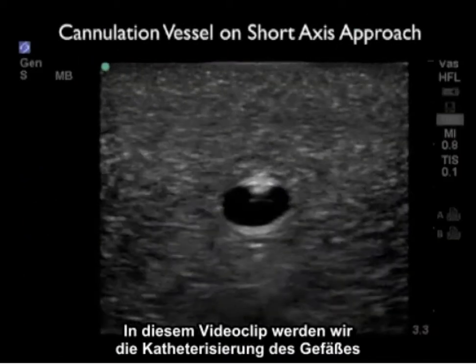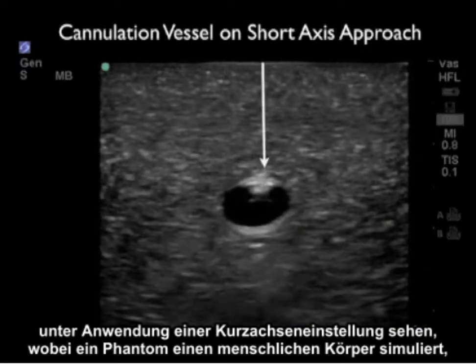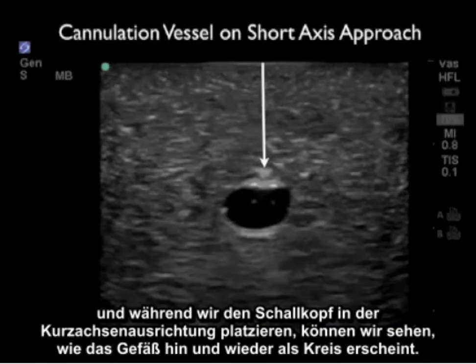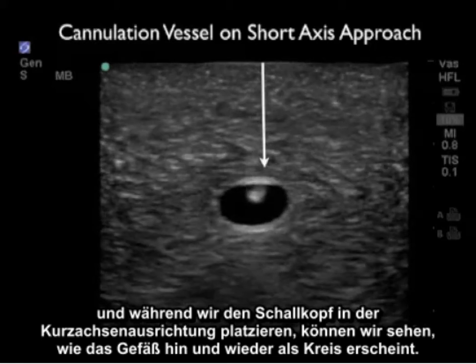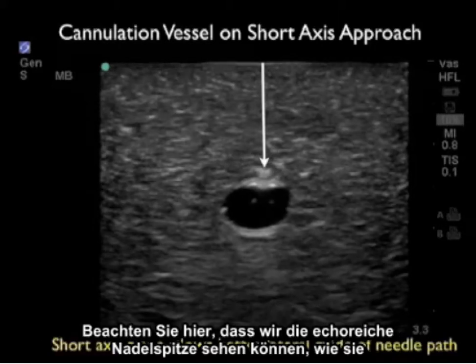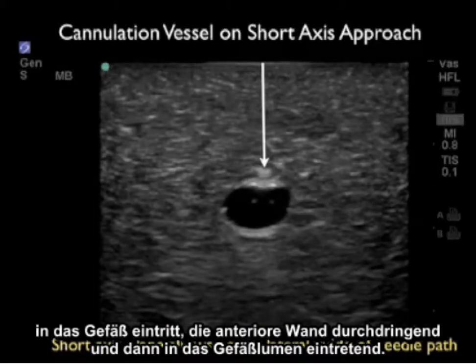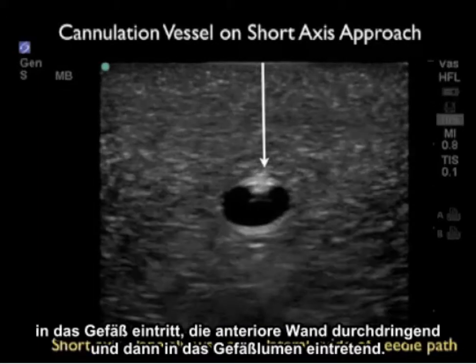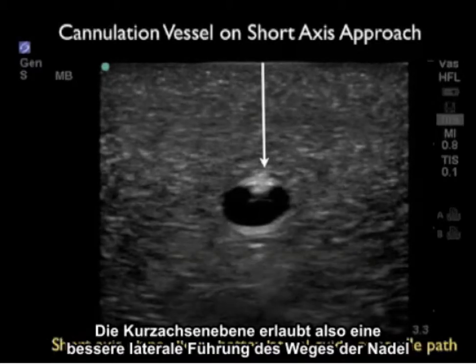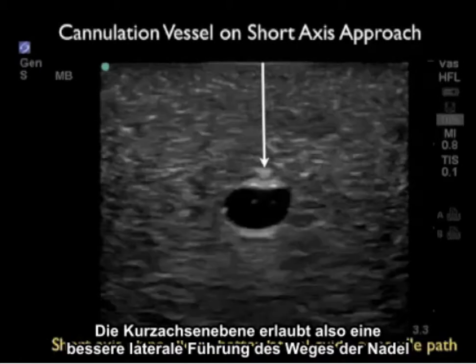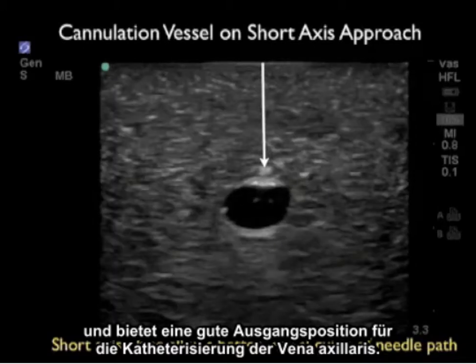In this video clip we'll watch cannulation of a vessel using the short axis approach on a phantom simulating the human body. With the probe in short axis orientation, the vessel appears as a circle end-on. We can see the echogenic tip of the needle coming down to the vessel, permeating the anterior wall, and entering into the lumen. The short axis plane allows better lateral guidance of the needle path and is a good starting position for cannulation of the axillary vein.